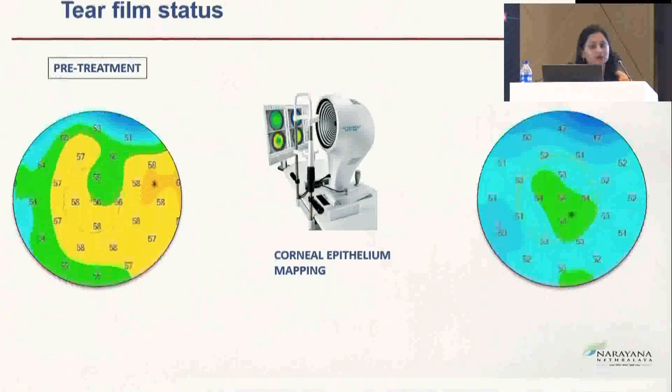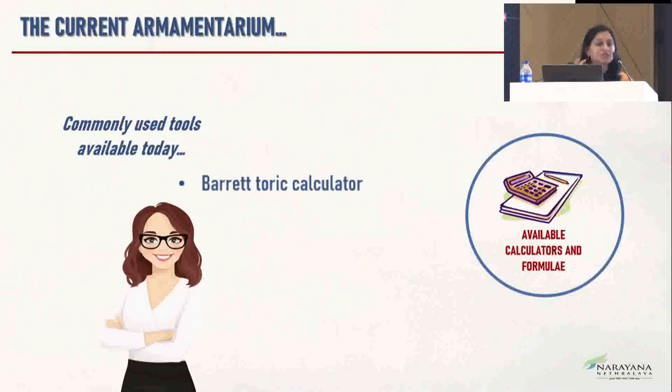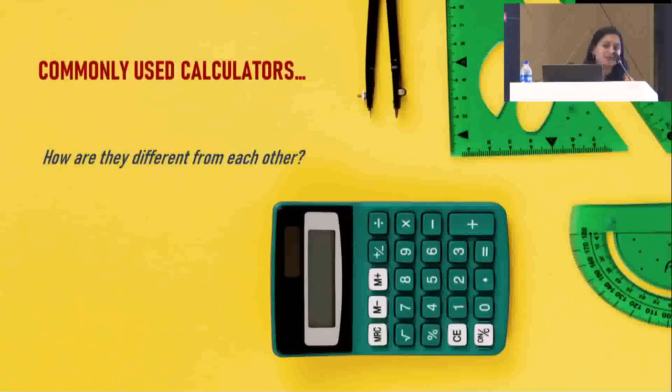Currently, we have a lot of online calculators available, but the commonly used formula is the Barrett-Toric calculator, because it's very important to calculate the posterior corneal astigmatism. Only if you take the anterior cornea, you'll be overcorrecting the with-the-rule astigmatism and undercorrecting the against-the-rule astigmatism.